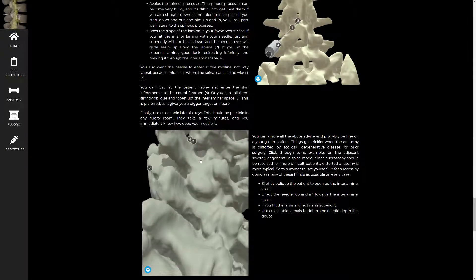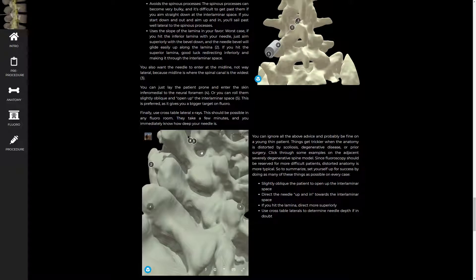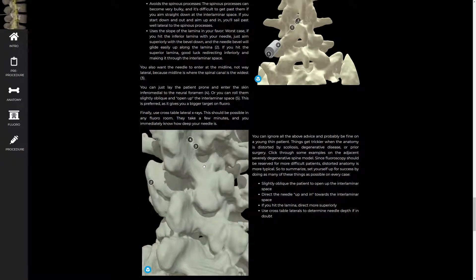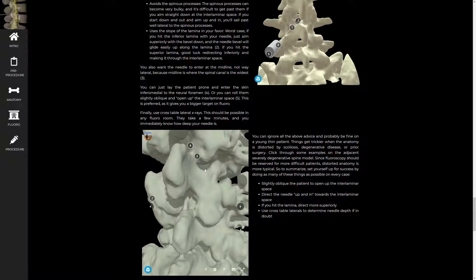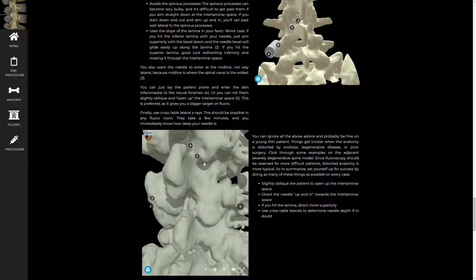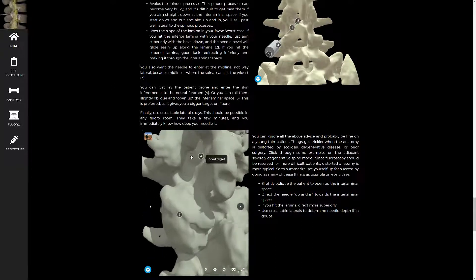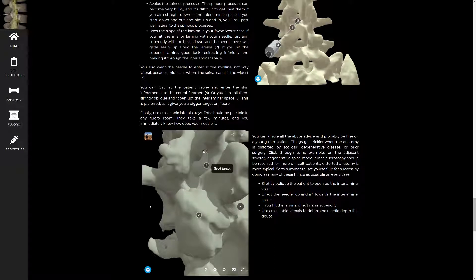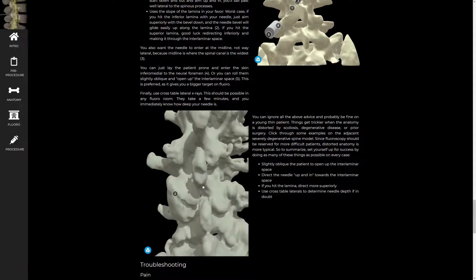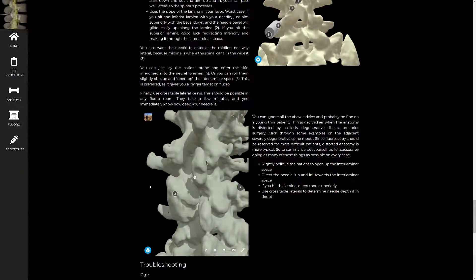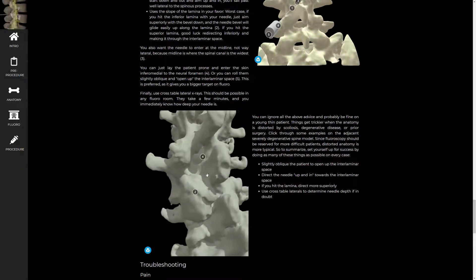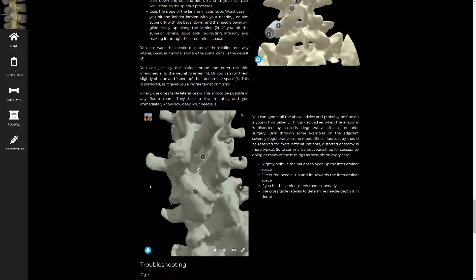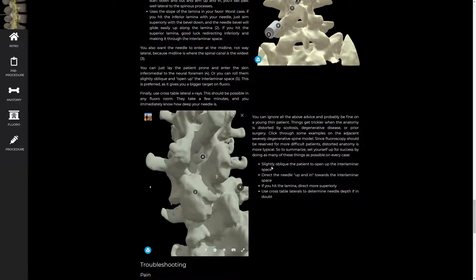Sometimes there's no space at all just from a combination of osteophytes from different sources. So if you don't get in at a level, you might have to try another one. I always tell people to prep wide when you have somebody with severe degenerative disease and plan on trying at several levels if necessary. But you can usually find a level. Here's an example of a good target within the interlaminar space. You probably would have to oblique the patient to make that stand out. The spinous process might block that. So all the tools of starting down and out and going up and in and obliquing the patient would be key to getting this lumbar puncture.